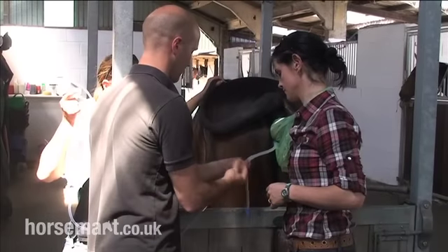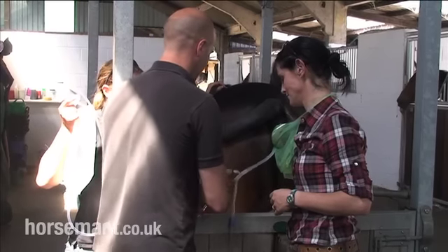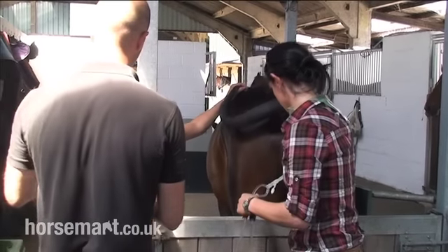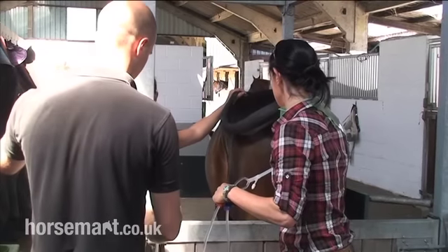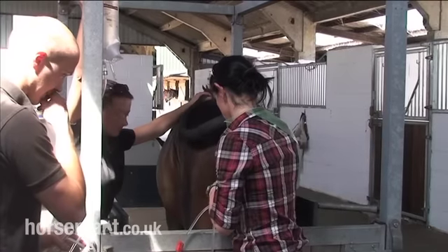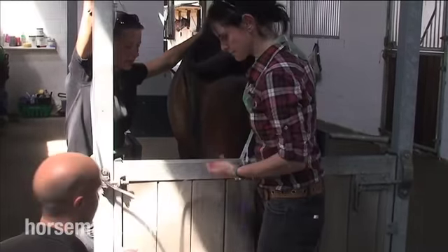Jamie's in the process of introducing air into the cuff at the end of the Foley catheter, which has now been placed inside the mare's uterus. In a moment, the Foley is pulled back just a little bit to position the cuff against the cranial portion of the cervix — the head end of the cervix. And now everything will be released and the fluid will be run into the mare's uterus.